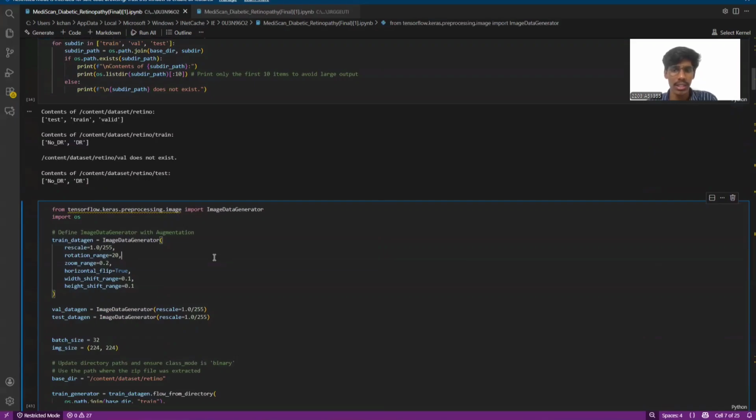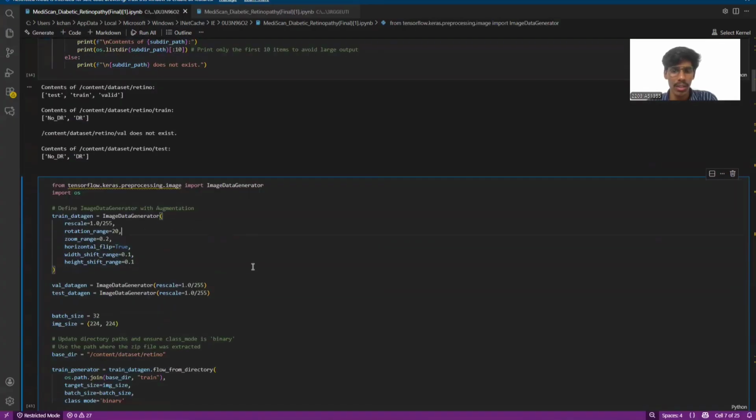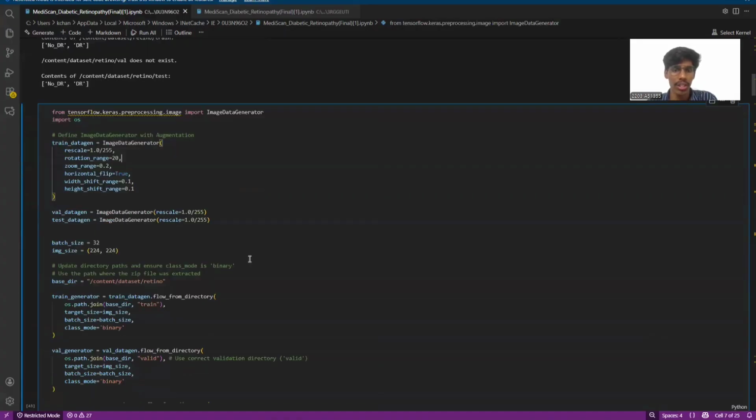In the sixth cell, it sets up the data generators that automatically load, resize to 224 by 224, and normalize your images so they are ready for the model. It also applies data augmentation specifically to the training set to help the model learn better by seeing more variety, while keeping the validation and test setup unchanged for fair evaluation.